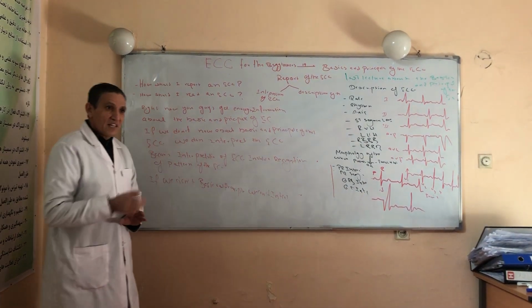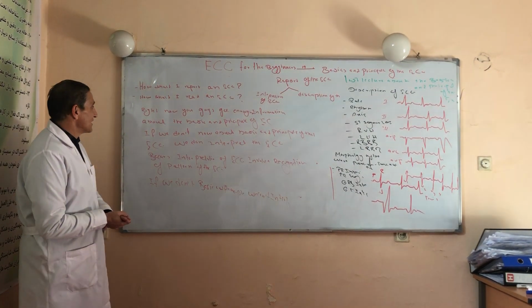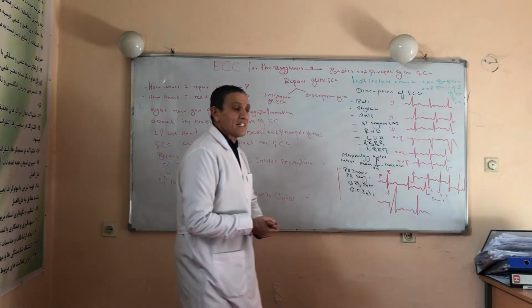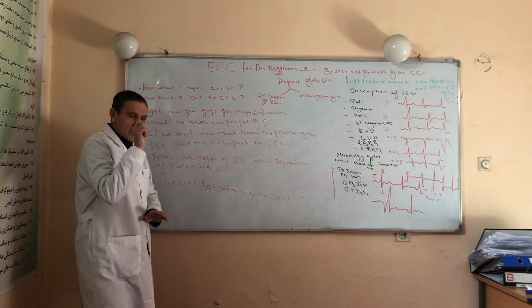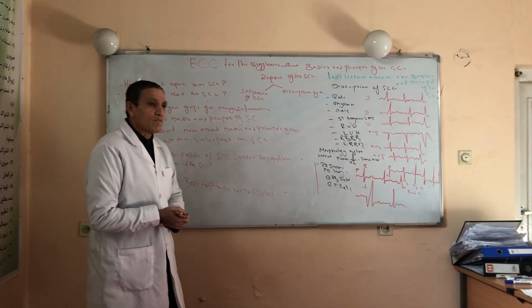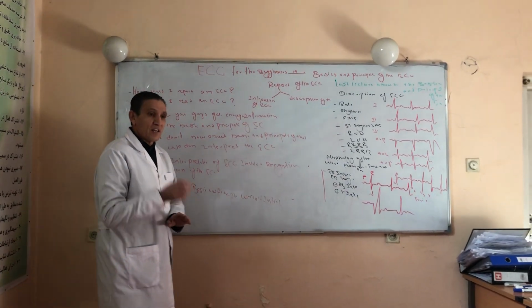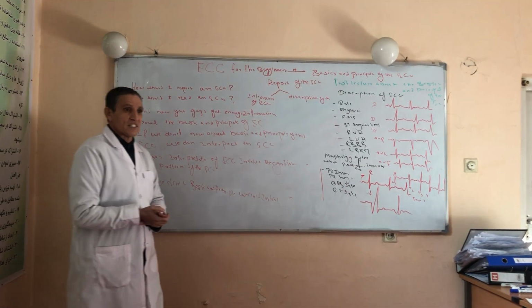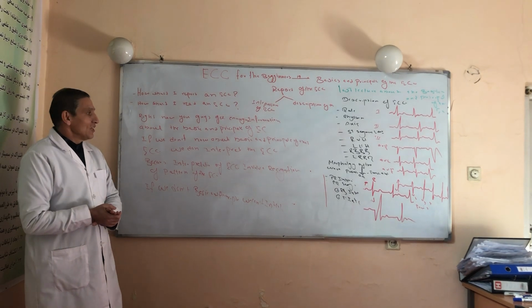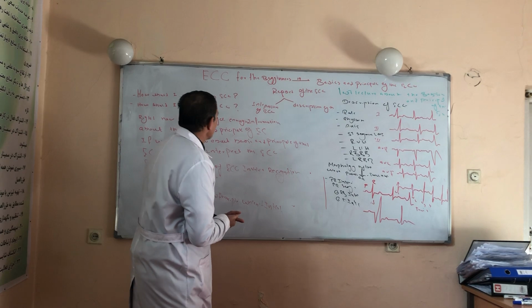So basics and fundamentals of the ECG are very essential for interpretation. Remember, interpretation of the ECG involves recognition of the pattern of the ECG. If we don't know the pattern of the ECG, we can't interpret it. So this was a very short lecture.